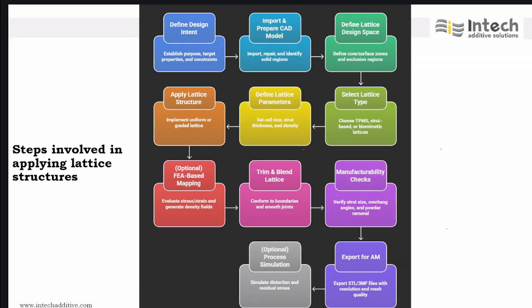The next step is to import and prepare the CAD model. You need to repair the CAD file in case it has got some import errors.